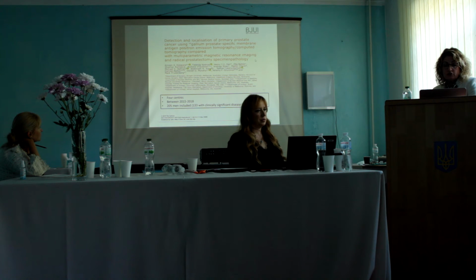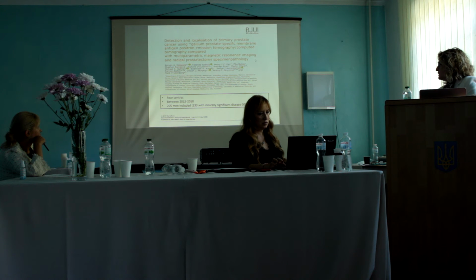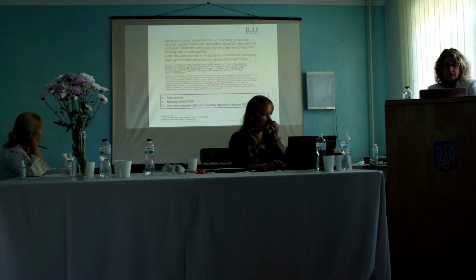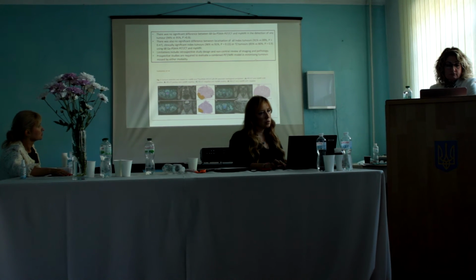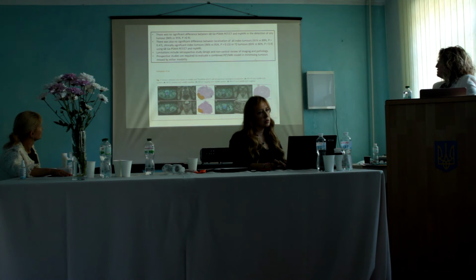A retrospective review of men who underwent gallium-68 PSMA and multiparametric MRI for primary prostate cancer before radical prostatectomy across 4 centers between 2015 and 2018. 205 men were included in the study. They defined the pathological index tumor as the lesion with the highest International Society of Urological Pathology grade on radical prostatectomy specimen pathology. Their primary outcomes were rates of accurate detection and localization of the radical prostatectomy specimen pathology index tumor using gallium-68 or MRI. The other study.